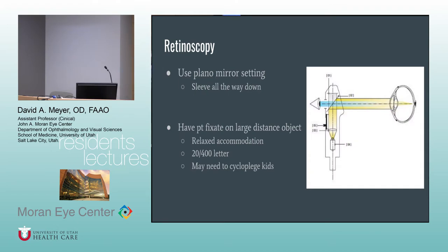So when you're using your retinoscope, I probably should have brought one, use the plano mirror setting. That basically means just put the sleeve all the way down. Have you guys gone through retinoscopy? You have, generally? Okay. I assume you've gone through it at least a little bit. But you put the sleeve all the way down, have the patient fixate on a large distance object just so they can relax their accommodation.